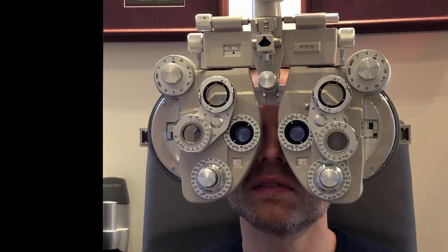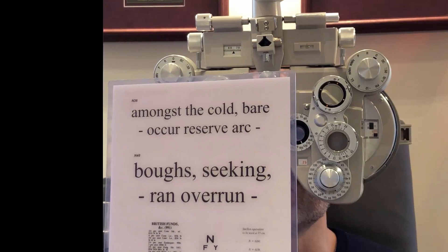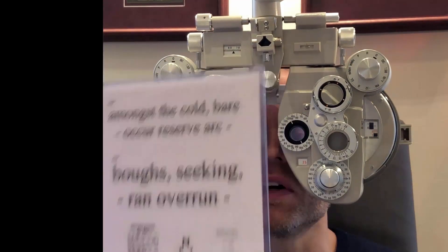So the smallest you can see there? H, C, D, R, O. And here? The top one still. So you're switching nice and easy, nice and quick? Yes, that's very comfortable. I can see both easily.